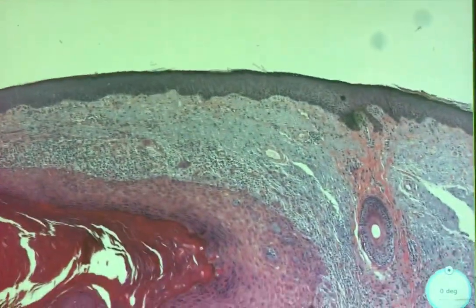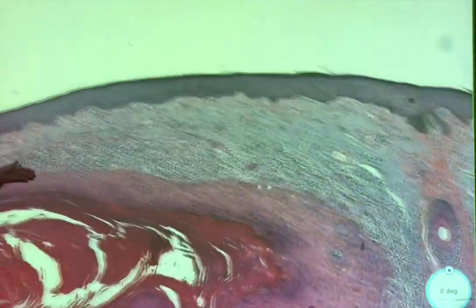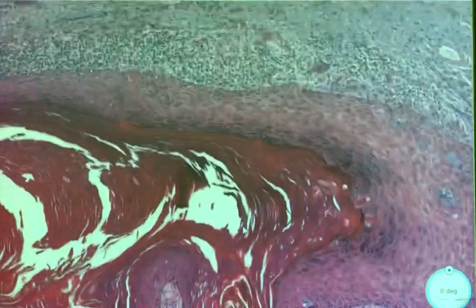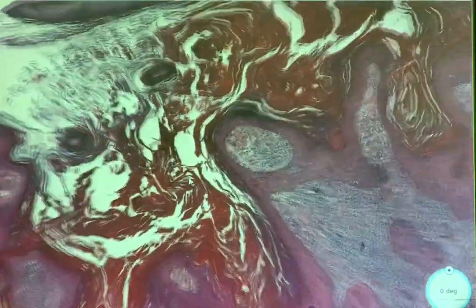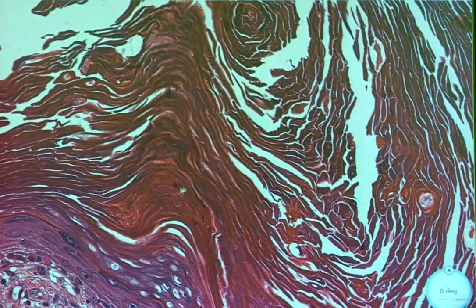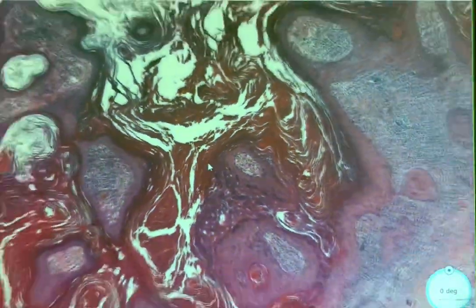And judging from the rest of the epithelium, this is definitely acanthotic too. Well, and as you pointed out, how pink it is. The difference, right? And it's keratinizing, kind of also like a verruca. It looks like it's kind of steepling, too. That's all keratin, right? It's all keratin. I think it's acellular for the most part. I think these are just debris, not really parakeratosis. Yeah, it's acellular.